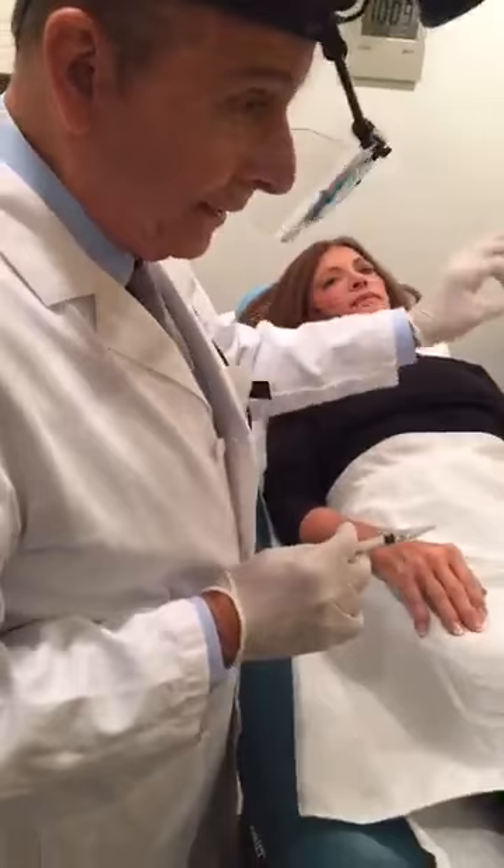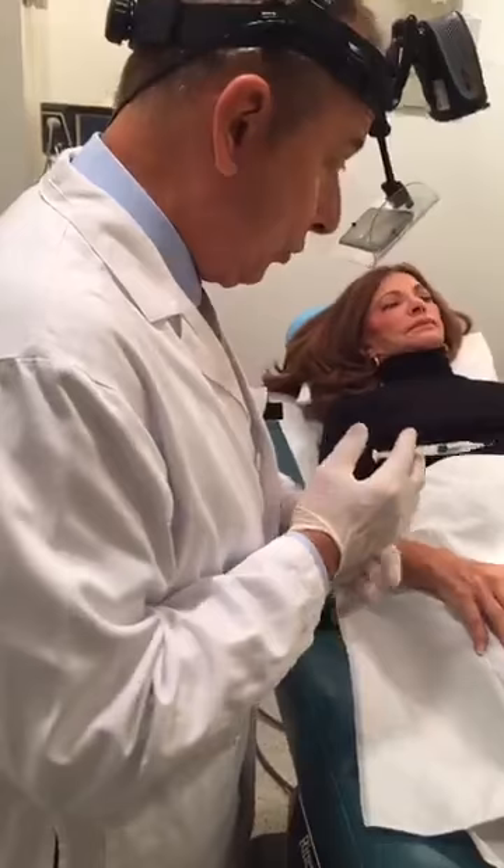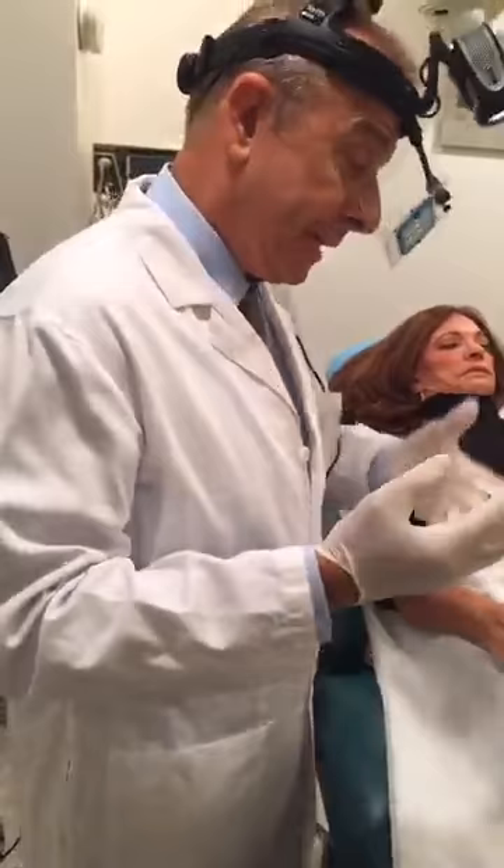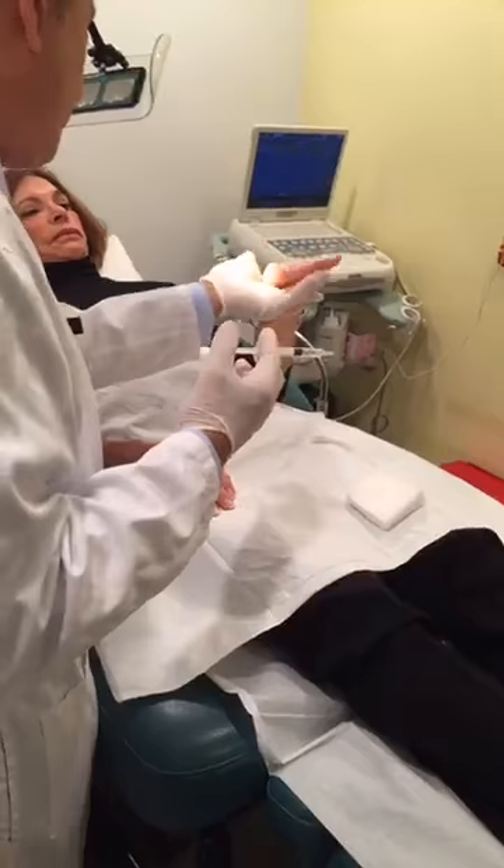We'll keep injecting all the veins on both hands. We'll do one hand first, then we'll put a glove that she will wear until tomorrow morning, and then we'll do the other hand. Usually it requires from one to three treatments, depending on the amount of veins, the size of the veins, and how you heal. Some people heal very fast, some people it takes a little bit more.